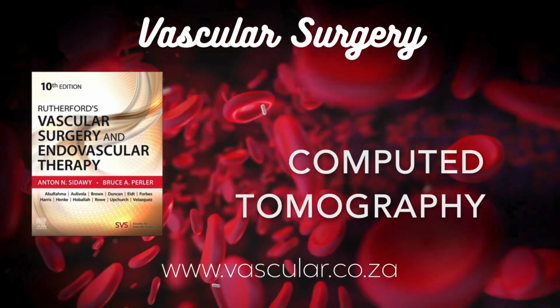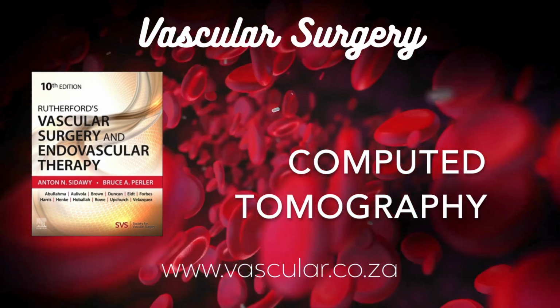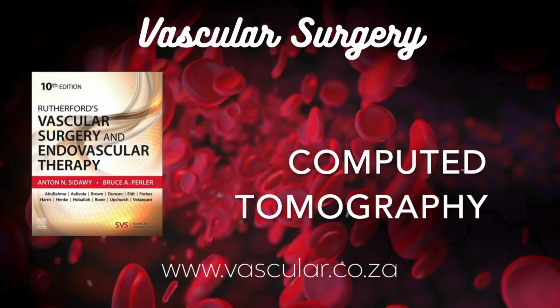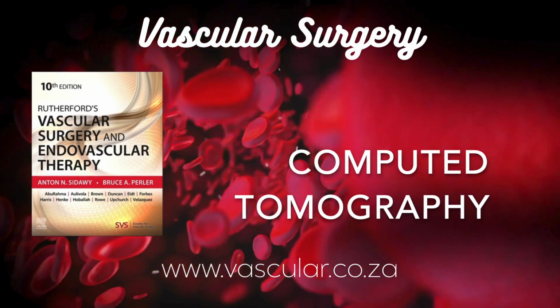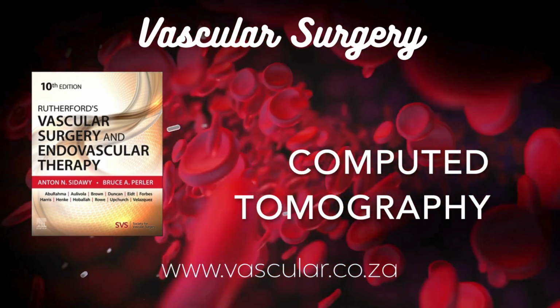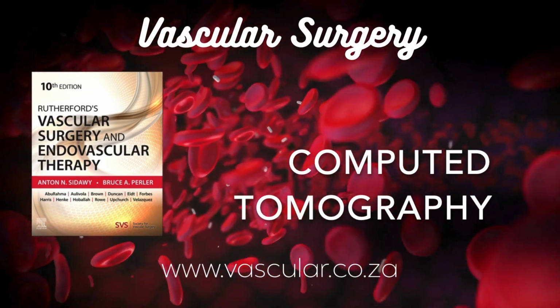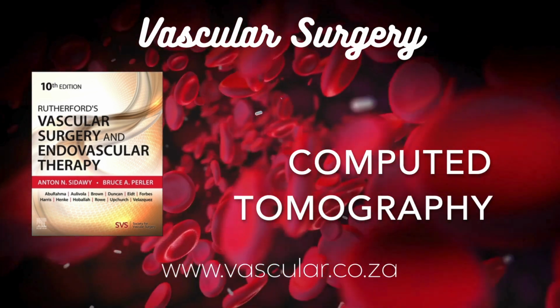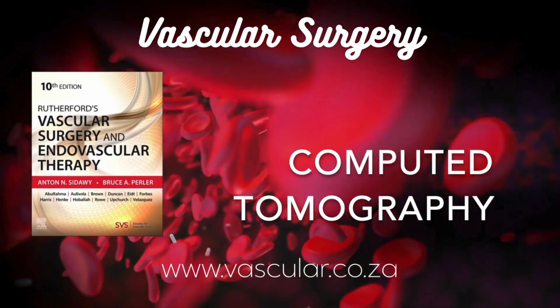Crucial. In an acute aortic dissection or rupture, speed is vital. Modern CT delivers that. For the ascending aorta, near the heart, using ECG gating helps freeze the motion for clearer images. Any advantages over MRI for the aorta? Big ones are imaging calcium, essential for planning stent graft landing zones, and dealing with existing metallic stents or grafts. CT has far fewer artifacts from metal than MRI does.